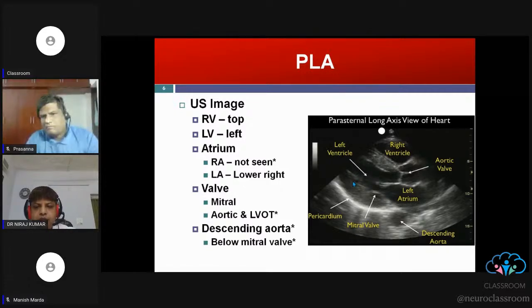If there is a good percentage of shortening of this ventricular cavity, that means good contraction. Another way of assessment is the mitral valve leaflet movement. If there is a good contraction, this leaflet will just touch the interventricular septum. We will see later how the contractility is assessed.